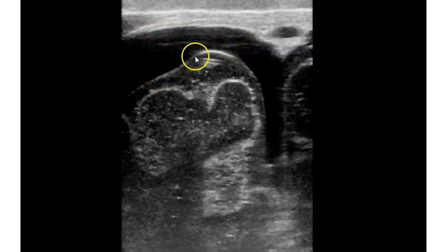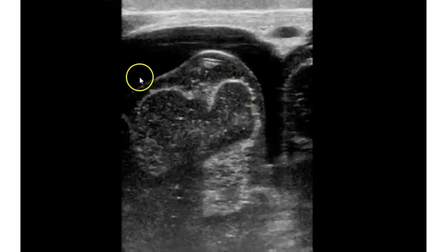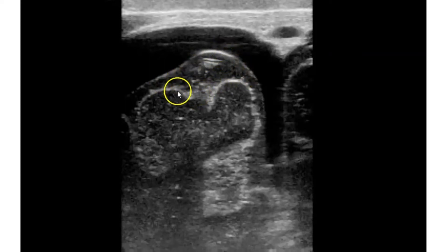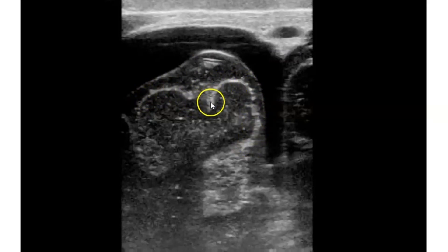And then you have the arachnoid membrane right here. Under the arachnoid membrane, you can see the more echogenic fluid with the crossing vessels as well. This is a typical area where we see the extra-axial fluid, especially the benign enlargement of the extra-axial spaces. And then around the cortex of the brain, you can see the pia membrane of the pia matter.